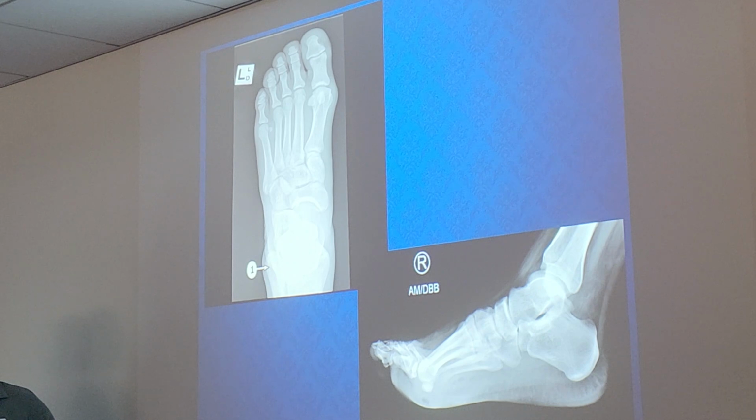It's lateral because it's coming from this other side. Is it entering the middle of the foot? No, we're not saying medial lateral because it's going through the middle of the foot. It's entering the medial aspect of the right foot.